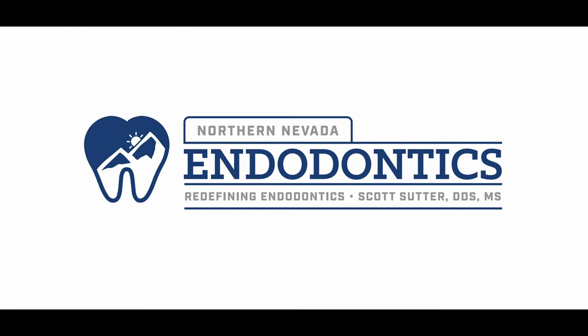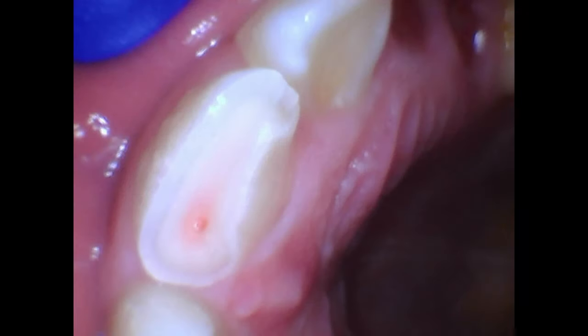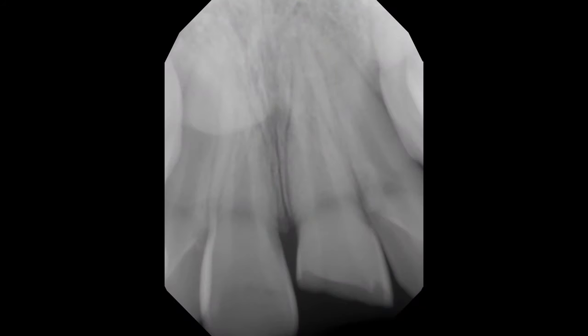I got an interesting one for you today. Here's a trauma case. This is the image that was sent to me by the general dentist. 11-year-old kid took a header off of a scooter, had this complicated crown fracture. This is 3 days before I was able to get him into my office.